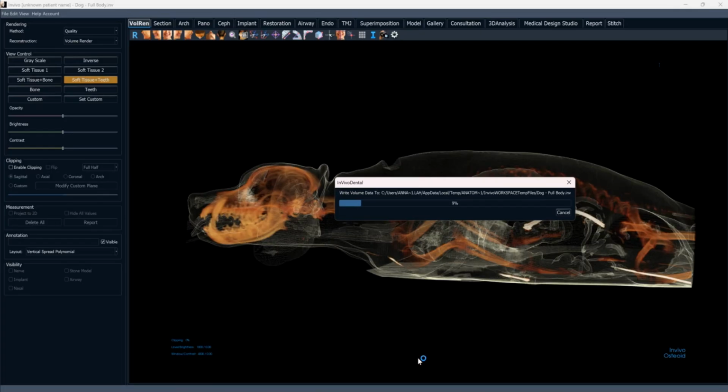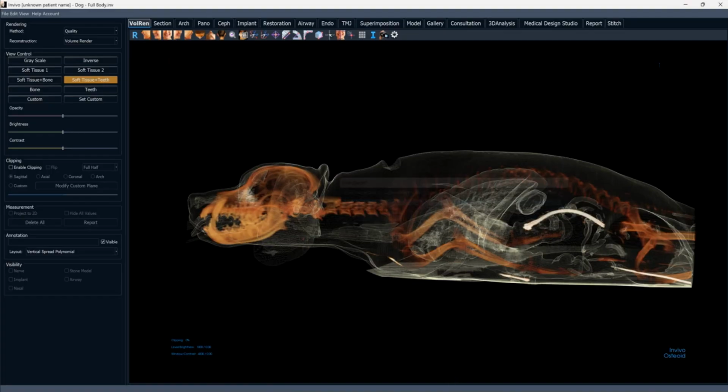So we'll go ahead, we click send there. It's going to do a couple of upload processes. The first one is where it's sending it right up to the case dashboard, and then it's going to do an extra bit of thinking here as it uploads. And it came right to my other screen. There it is. So we've got it successfully sent.